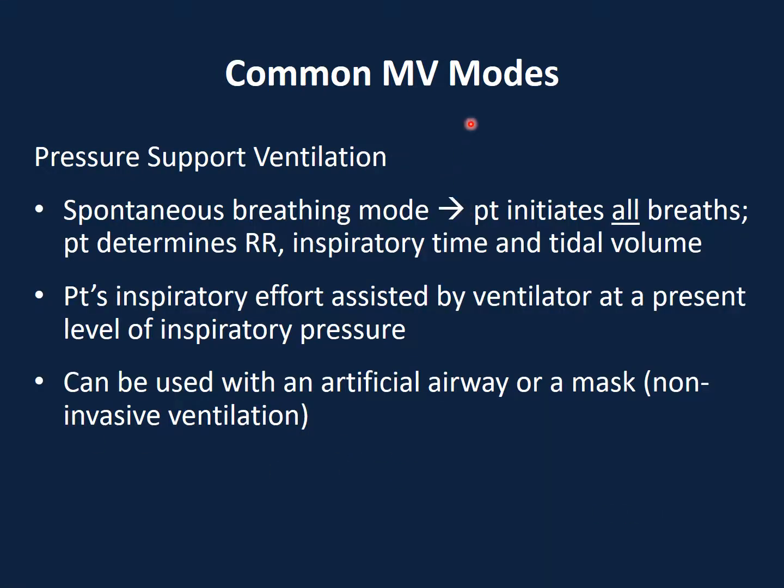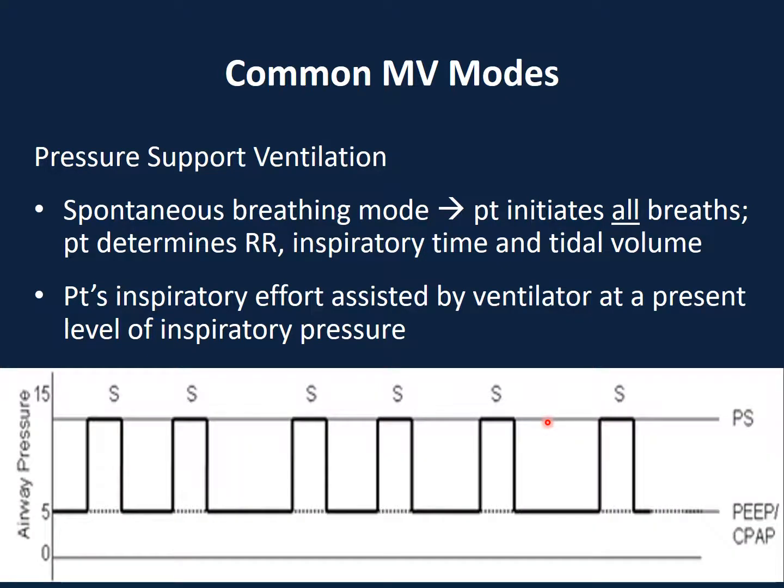Pressure support ventilation, also a spontaneous breathing mode. In this case, we have two pressures, right? So just know that it's a spontaneous breathing mode, which means the patient initiates all breaths, and determines the respiratory rate, inspiratory time, and tidal volume. It can also be administered through an artificial airway or a mask as non-invasive ventilation. So in this case, we are referring to two pressures. So please disregard this CPAP here.